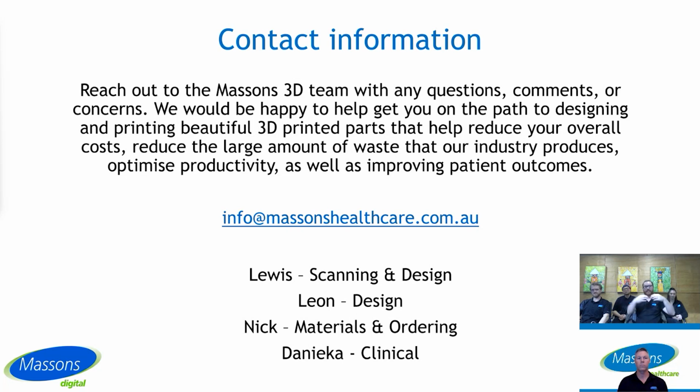Pointing down effectively reflects the white light onto the bottom of the foot. The software does all the hard work of stitching what ends up being more or less two separate scans. Because of the way the module is calibrated, it knows to flip the bottom and stitch it on appropriately. We've got videos up on our Instagram showing what that module looks like in action as well. Great, thank you.